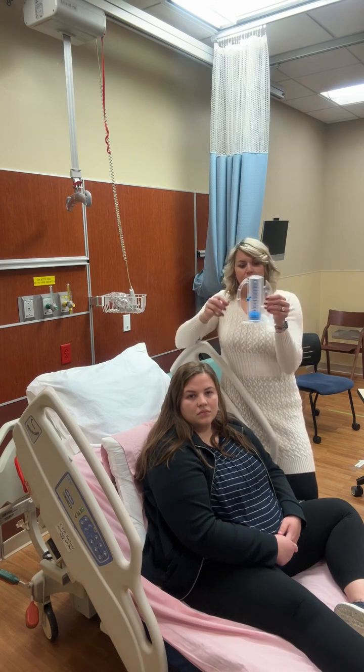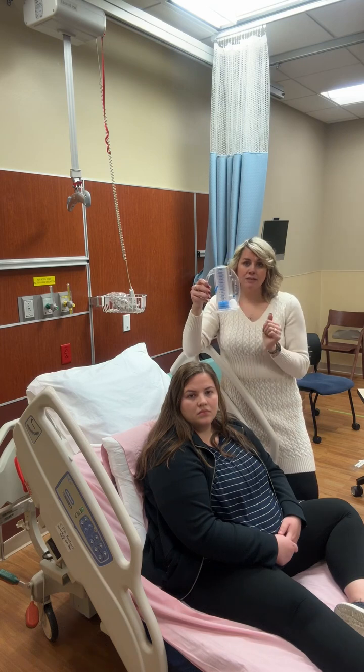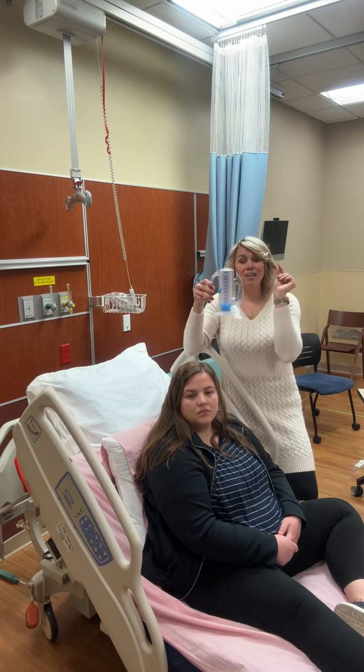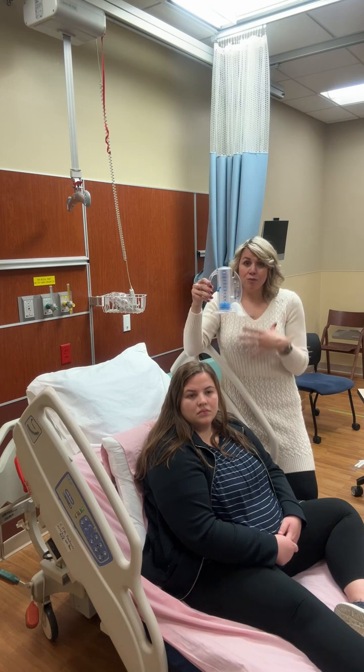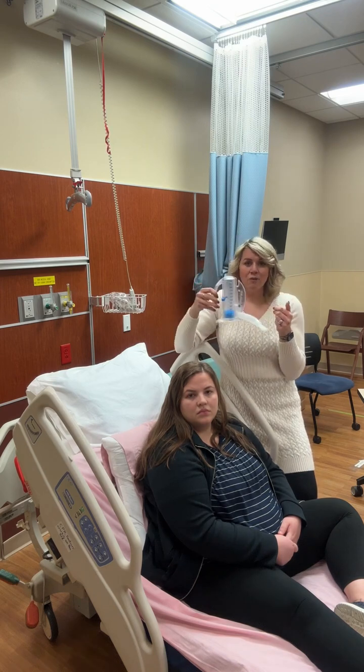The way to do that is that there's an indicator over here that is going to go up when you take a breath on the mouthpiece. If you breathe too fast, this indicator is going to hit the top of this part here and you're going to hear it. And if you do that, some things are going to happen. One, it's not going to be effective. Two, it's going to hurt, especially if you have some sort of trauma to your chest and you breathe fast like that. It's not going to feel good, and probably the patient is going to be like, nope, get rid of this. I don't want to do it no more.